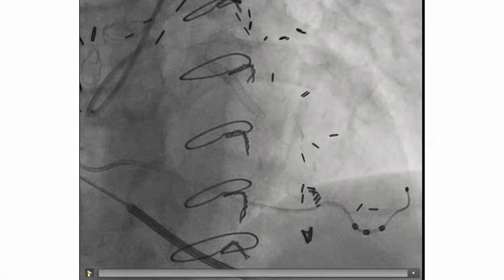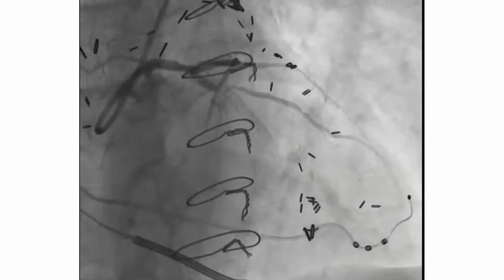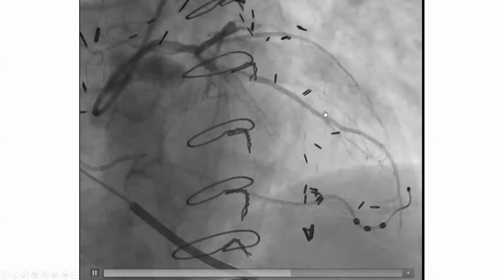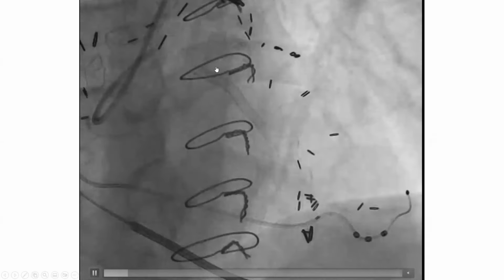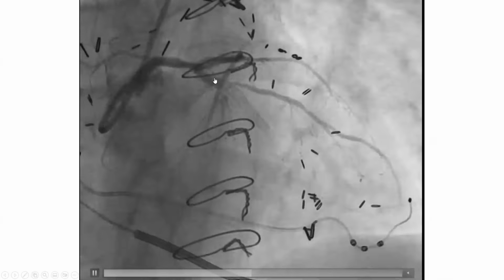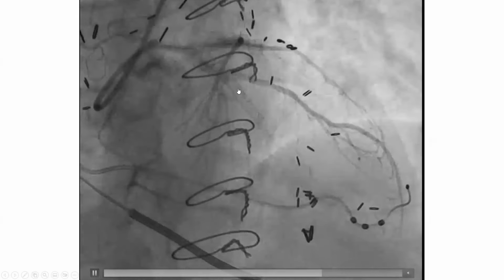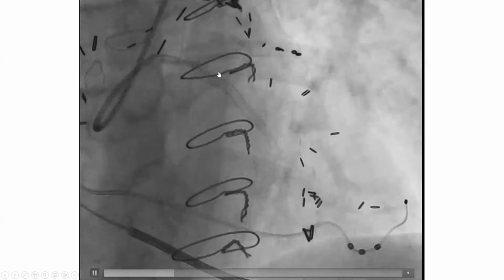This is another case. This is a patient with prior CABG and patent LIMA to LAD. The problem is the impaired native flow into the diagonal that's causing him to have angina. He has severe restenosis inside 2 layers of stent in the proximal LAD leading up to that diagonal, and he has severe stenosis of the diagonal ostial area. So we want to treat that whole area.